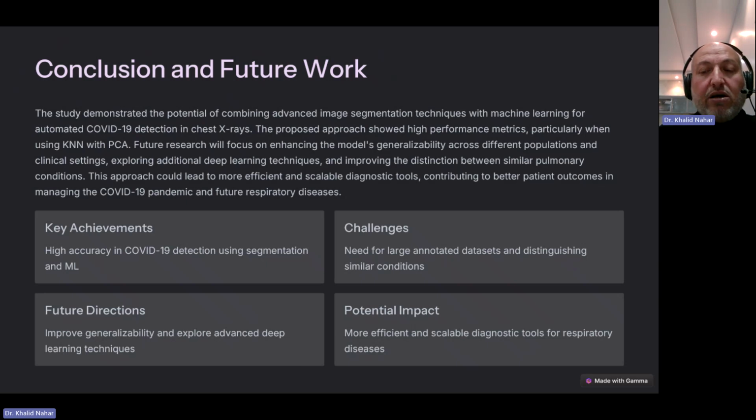After getting this portion from the X-ray image by the segmenter, extracting the features and applying PCA on these features, we got a very promising result, which means that if we feed these segments to a deep learner, we can get even more accuracy, which will be kept as a future direction for comparison with our methodology.